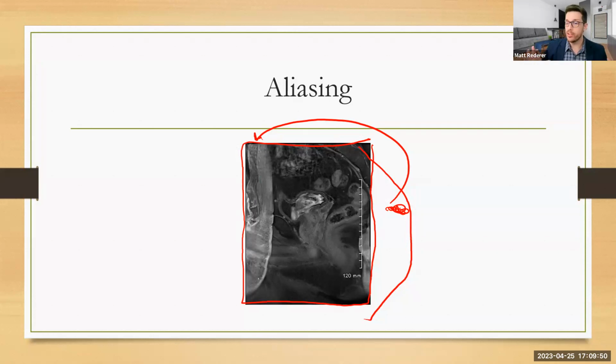We have a field of view. We forget to either open up our field of view big enough to include everything, or use special techniques, what we call anti-aliasing techniques. It sounds fancy, but it's just a technique where we sample a little bit outside of our field of view to compensate for this artifact. But typically it's I made a mistake, got to rerun it.